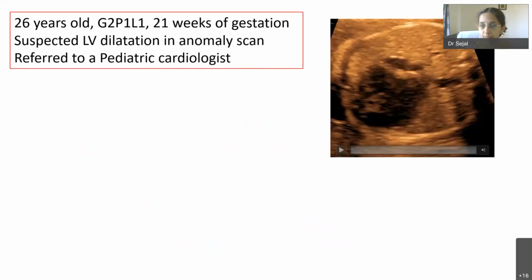Now, I want all of you to be interacting in the chat box because the lesions are very similar. All of you are comfortable understanding the concept of the lesion and how to pick it up postnatally. So it's going to be very similar. So it'll be nice if all of you could write your answers with every lesion as we go.